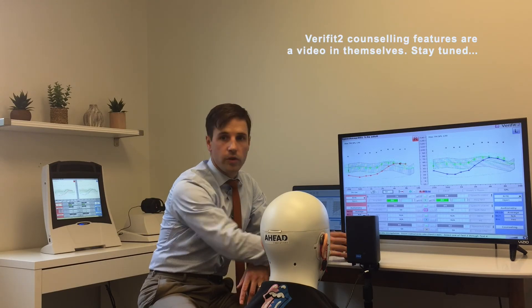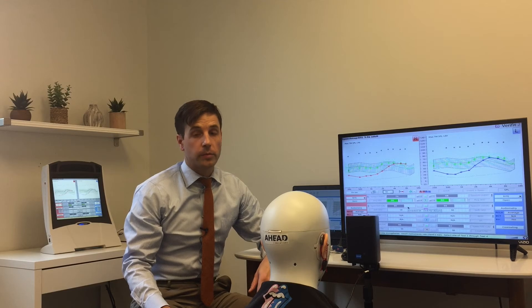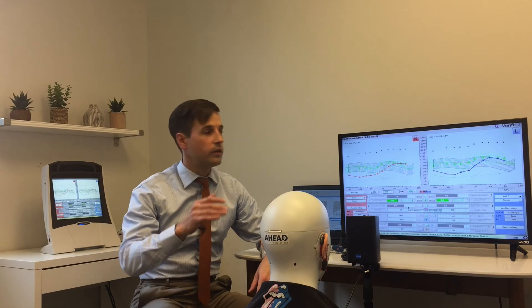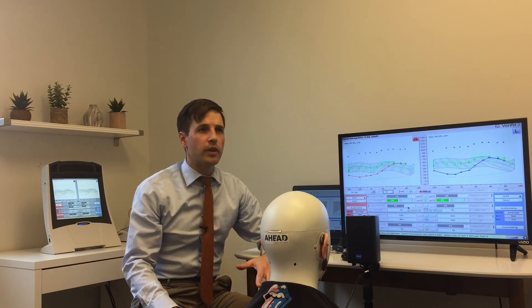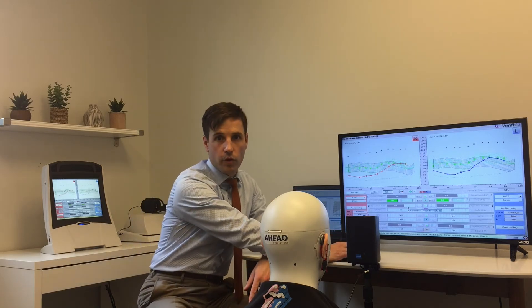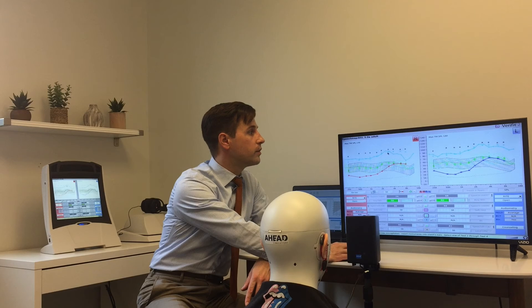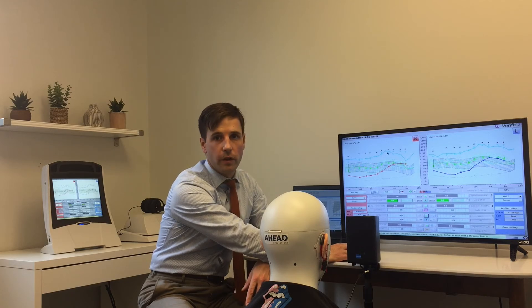I'd probably tell him that we're not meeting a full prescription right now because he'd find it a little bit too harsh, and we'll work toward that over time. At this point it's a good idea to take a step back and run a quick MPO to make sure the maximum power output is tolerable for the client and not exceeding his loudness discomfort levels. We're going to do that now because if there's something significant to change we want to get that out of the way early in the fitting, as it could affect the average curve. As this runs, I'd be keeping an eye on Carl to see if his eyebrows are going up — as most people do, especially as it gets right into the ear canal resonance on an open fitting — and I'd probably cool this down a little bit.